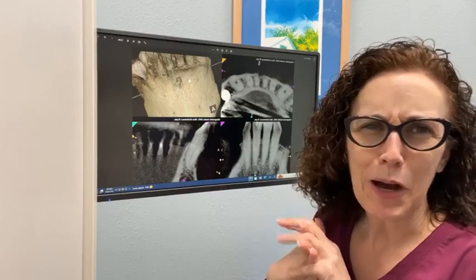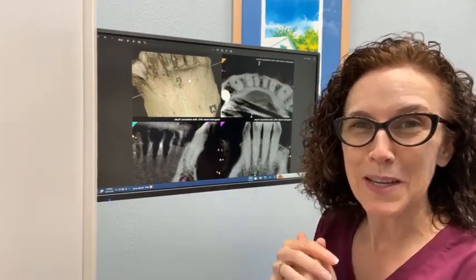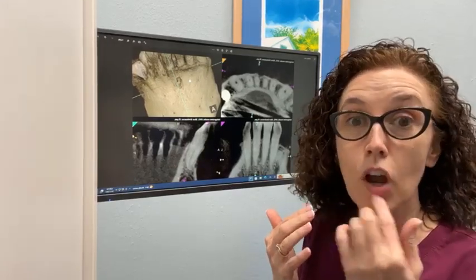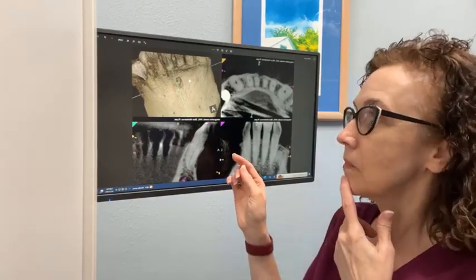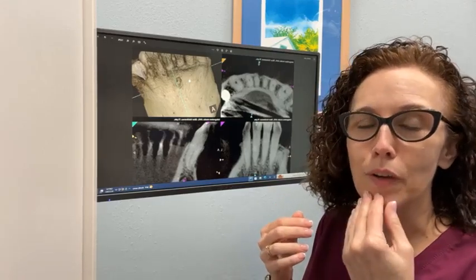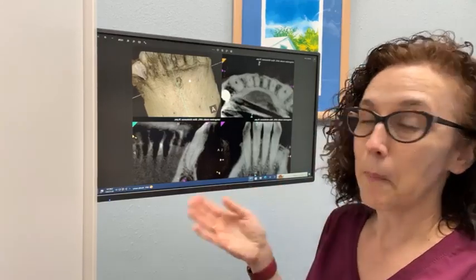It seems a little odd, but I think Halloween is one of the better times to even be thinking about it. It's almost like you could see the jawbone, the skeleton. So not the tissue, not the muscle or the skin or anything. You can actually see that bone.